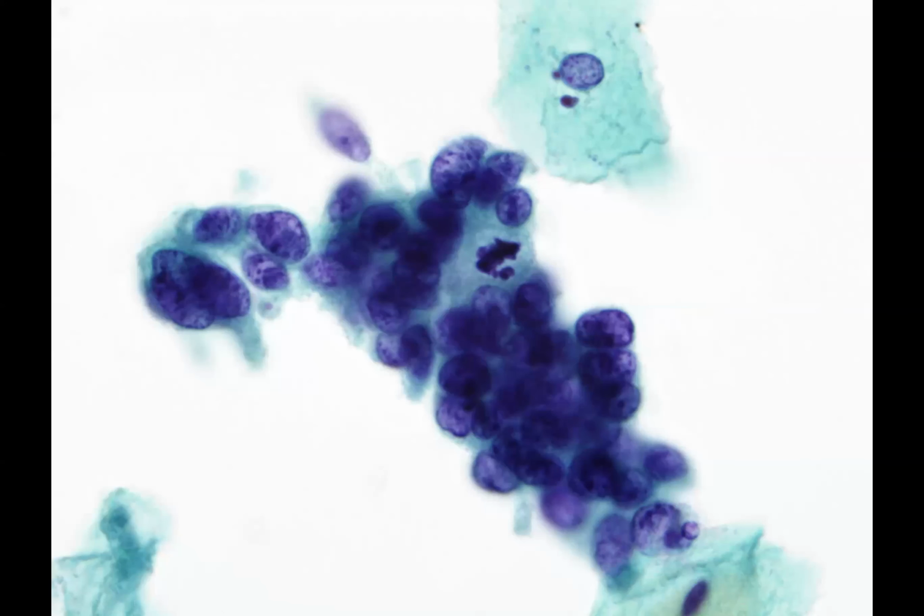It's the same with high-grade CGIN in cytology. To orientate you, this is an abnormal group. You can appreciate here the nuclear enlargement and elongation of the nuclei. All of the nuclei look hyperchromatic, but this photomicrograph has been taken to show this structure here. This is a mitotic figure. Whenever you see mitoses in endocervical cells, always look carefully at the cells that the mitosis is in and the cells surrounding. Occasionally you can see mitoses in reactive endocervical cells, but in my experience it's much more common to see it in association with high-grade CGIN.